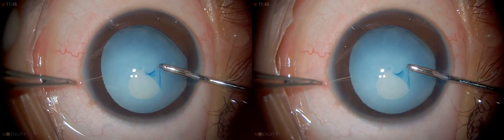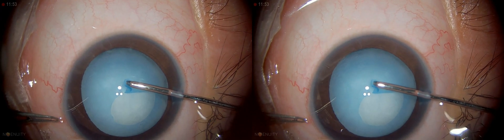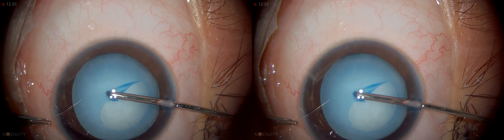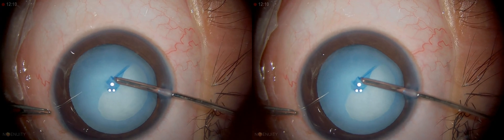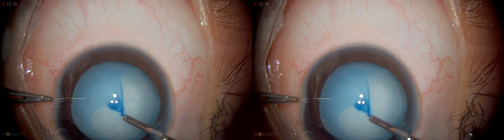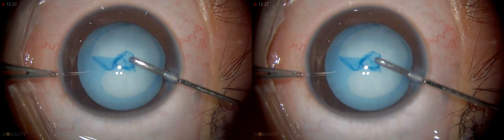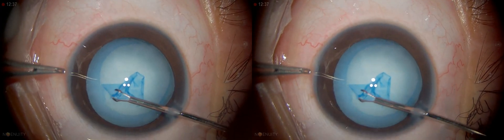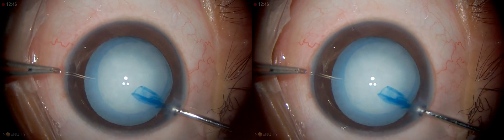You can see it is coming from the other side, but still — you have to grasp and re-grasp. Try to complete it. Change your direction each time you re-grasp. It's a bit swollen so you have to be careful — don't do too much at a time. Take your time, grasp and re-grasp, and then complete this. With the same flap you can remove this capsule.